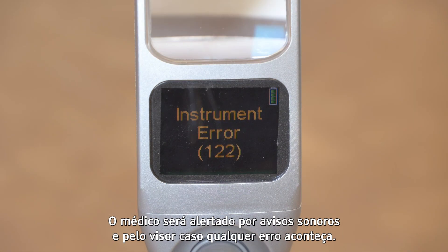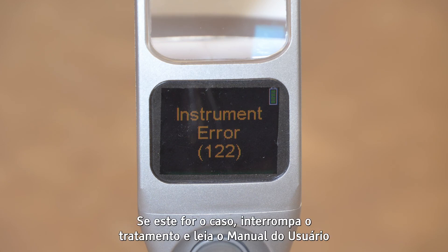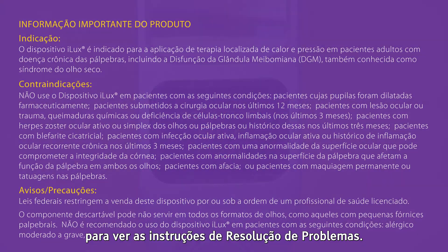The display screen and audible beeps will alert the clinician if an error occurs. If this occurs, stop treatment and refer to the user manual for troubleshooting instructions.